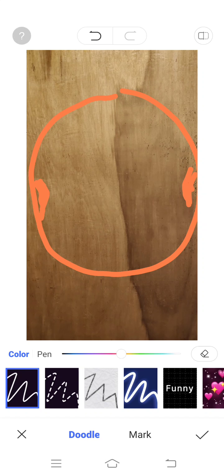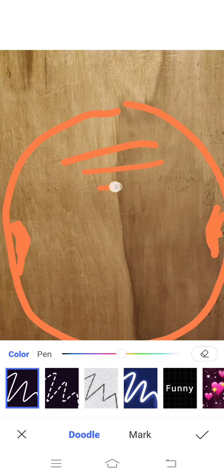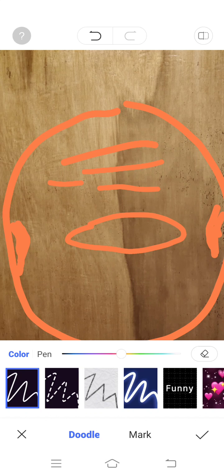You can't notice them. No, so you can see here the one for distance. Okay, the one for distance so big, wide. The one for intermediate is also very wide. Okay, and the one for reading is very wide. Okay, so that's the more advanced technology, and you know naman technology mo mahal sad.